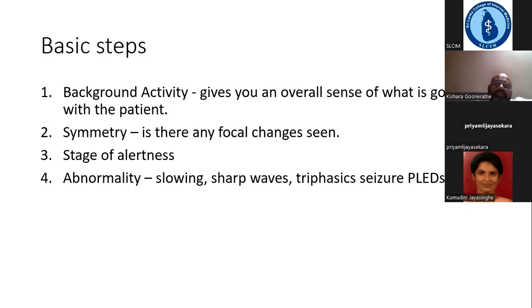Sometimes during an awake EEG, we are unable to pick up those epileptiform discharges, whereas when these patients fall asleep, we might be able to pick them up, especially when they go into N2 stage of non-REM sleep.